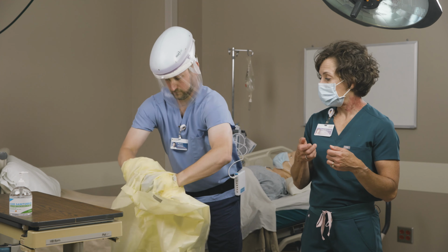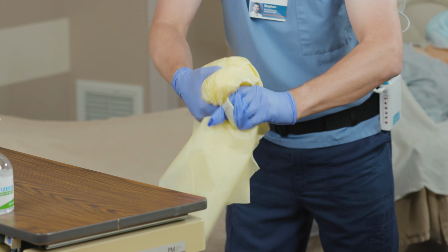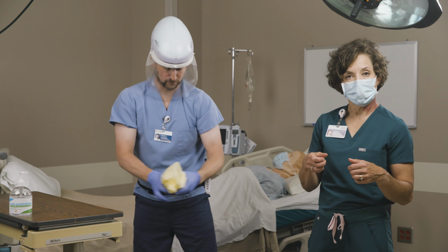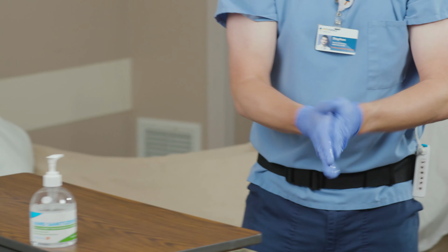But you're going to doff that gown in a nice, slow, methodical fashion as we did before, rolling it up into a small ball and gently placing it in the garbage can. And then he's going to perform hand hygiene. And then he will exit the room.